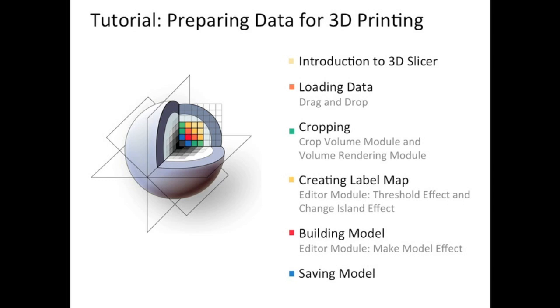Now we've loaded our data into Slicer and we're able to window level, zoom in, zoom out, and pan it around as we need to. So we can go ahead and start cropping that cone beam CT down to the region I'm specifically interested in. In order to do that, I'm going to use the crop volume module of Slicer, but I'm going to inform it with the volume rendering module, so that I can create a 3D volume rendering of my cone beam CT and then select the region I'm interested in using that rendering as a guide. So I'll begin by loading that volume rendering module first.